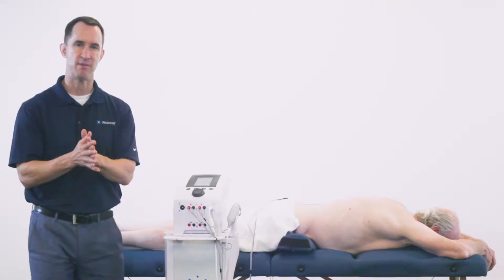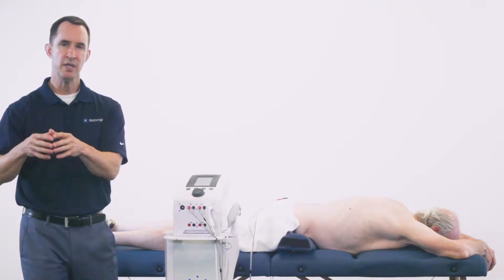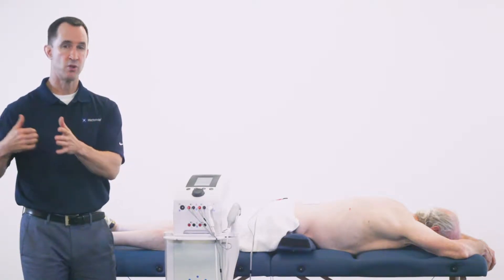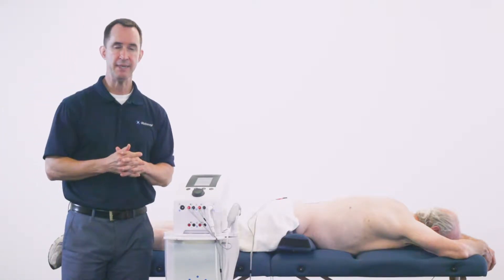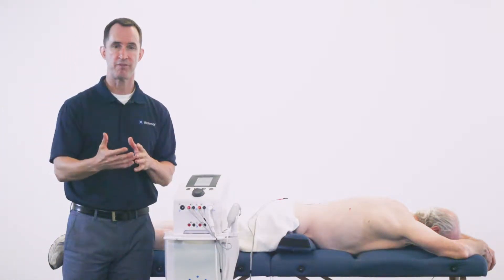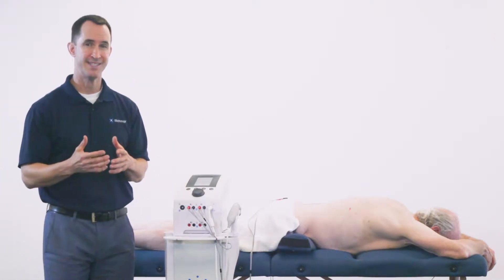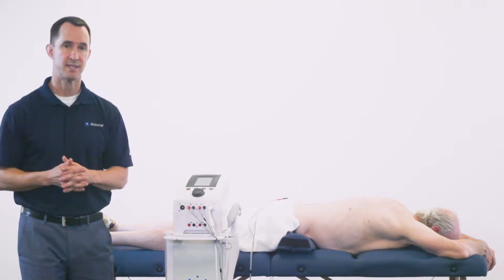A key clinical consideration: once the patient has progressed beyond the acute inflammatory phase, think about transitioning them into using this motor TENS approach for the subacute and chronic stage of their progression. Motor TENS is really the preferred method for subacute and chronic musculoskeletal conditions because it can provide much longer lasting pain relief.